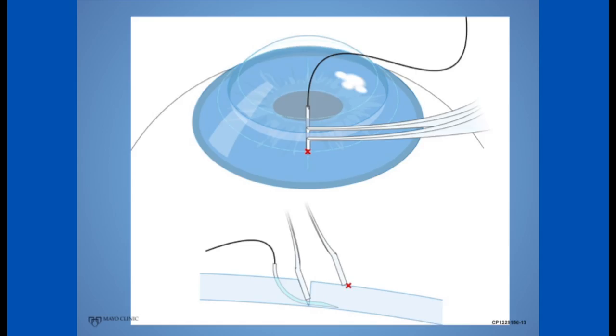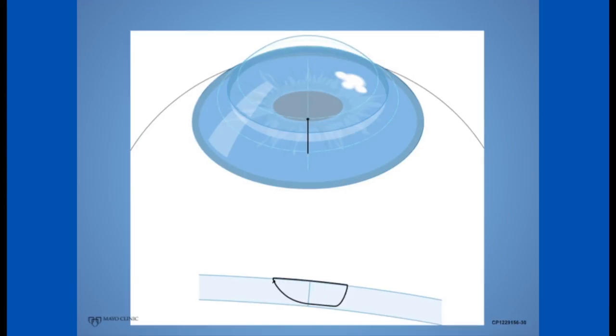In earlier videos, we learned how to drive the needle through the graft and how to drive the needle through the host so that it was deep, radial, and parallel to the posterior host surface.